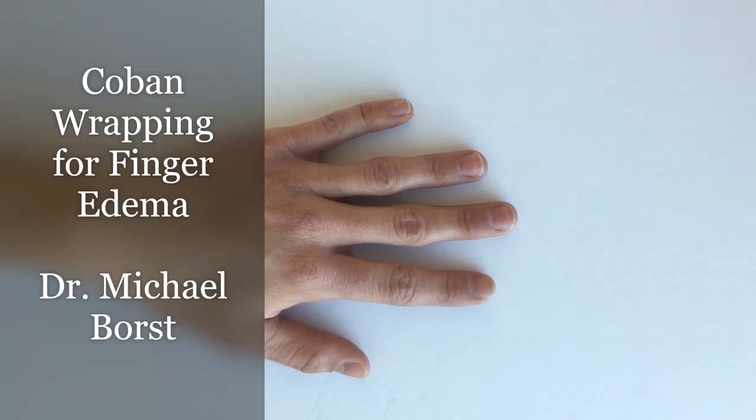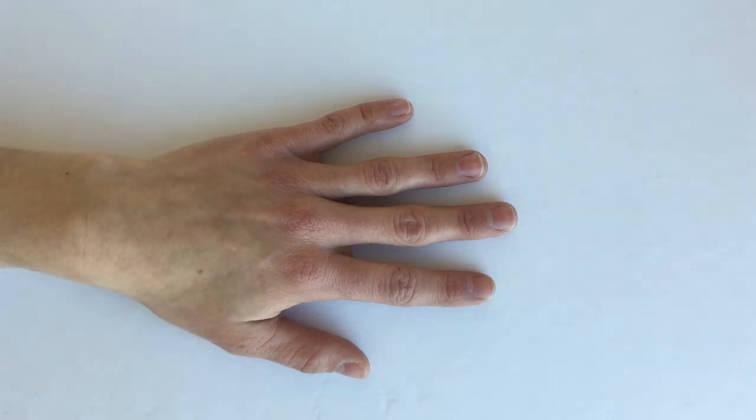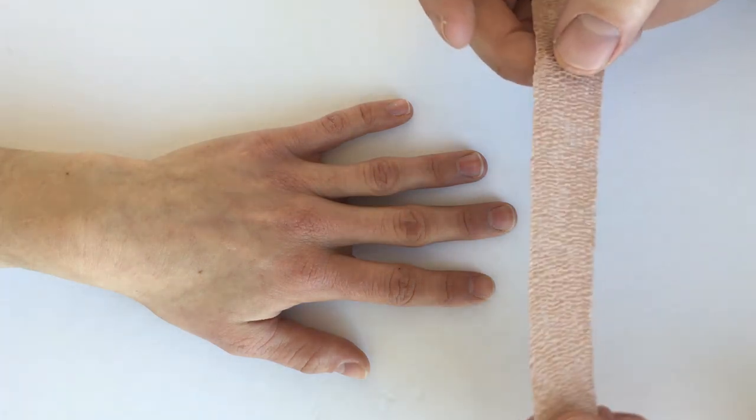In this video we're going to talk about compression techniques for edema intervention. The first technique we're going to demonstrate is the use of a Coban wrap for an edematous finger.